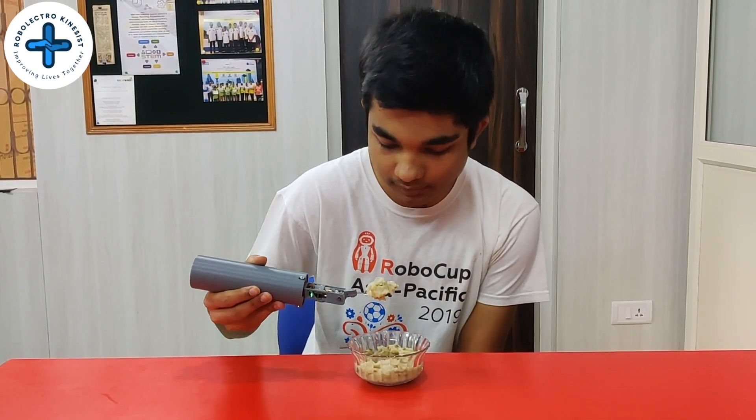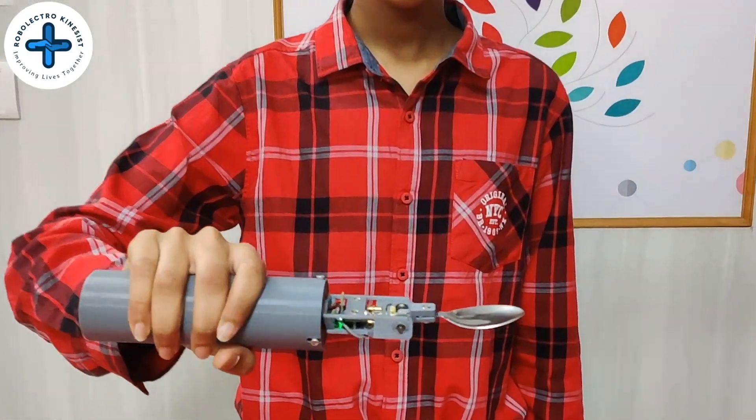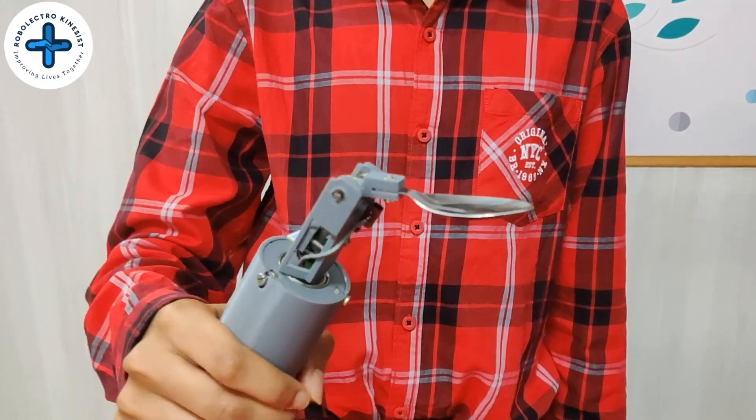This is our smart spoon and I am simulating a Parkinson's patient. Here is the roll compensation and here is the pitch compensation.